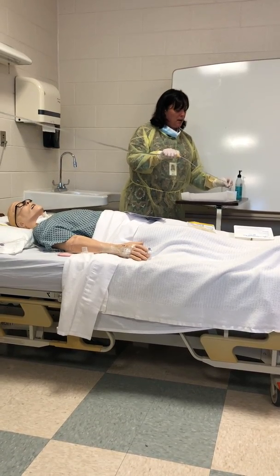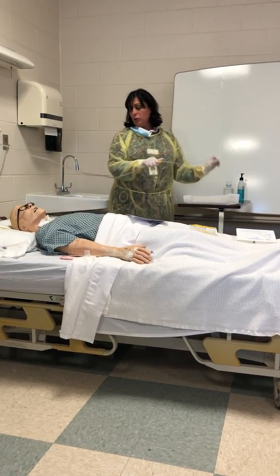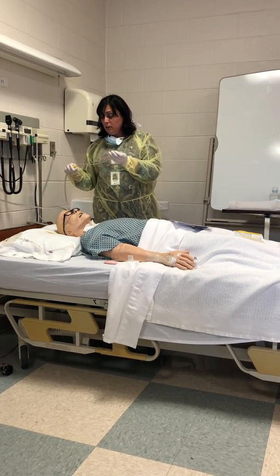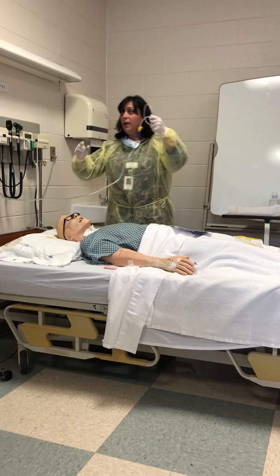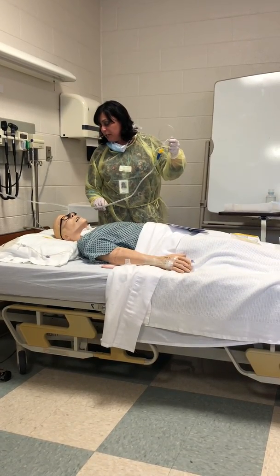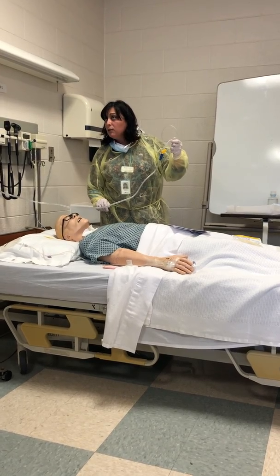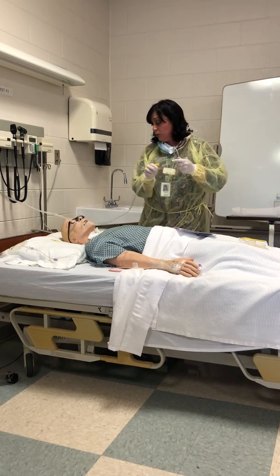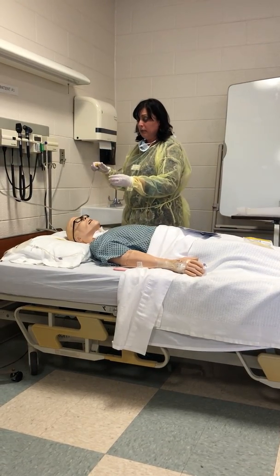Okay, so clean out your line. Good job. How do you feel? Feel okay? No, you still feel like crap? Okay. Take a couple big deep breaths. I'll put your oxygen back on. Take a couple big deep breaths. Your oxygen's coming all back up. Looks good. Okay, we're going to do this again because you look like crap and you sound like crap. I hear it still. We're going to come back out.